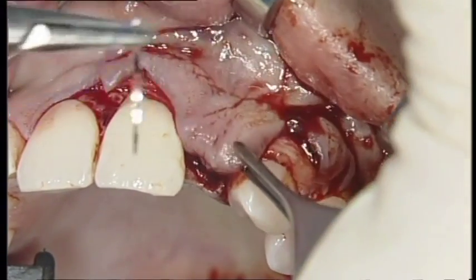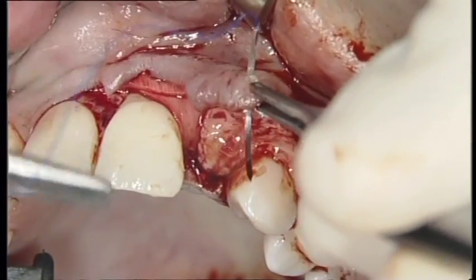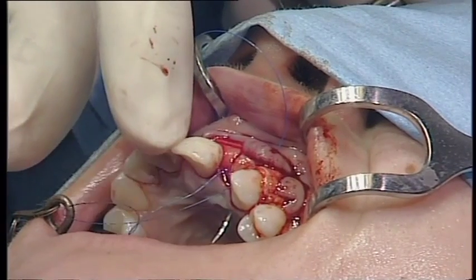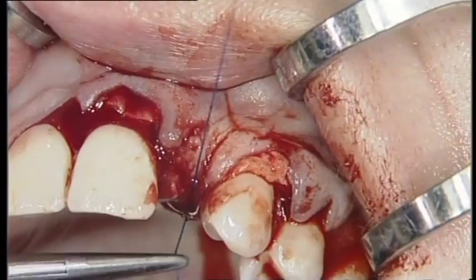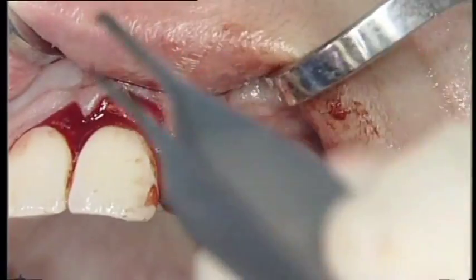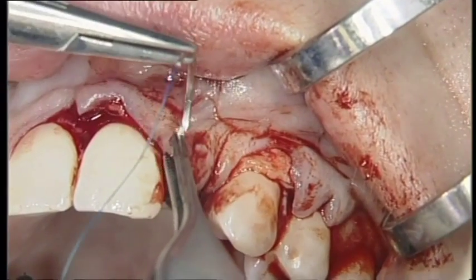The flap is mobilized to confirm the tension-free status. The tension-free wound closure is begun in the distal corner of the edentulous area with an interrupted single suture. Non-resorbable 5-0 polyamide sutures are used. An additional suture is added in the mesial corner of the edentulous space.